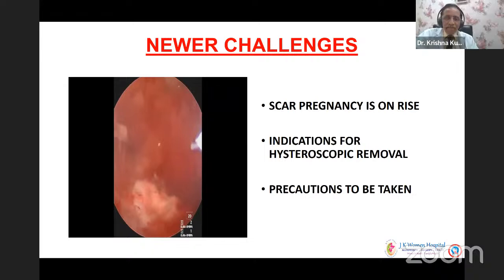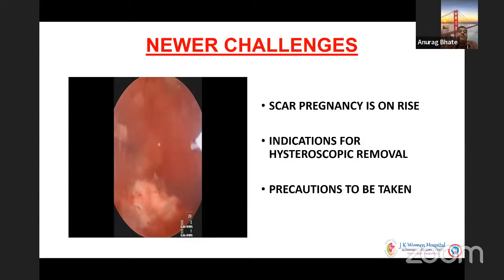No, Nitin is outside. Nitin is saying, just go inside and with the cold loop, just scrape out the entire tissue, and most of the time it doesn't bleed. Nitin, your signal is weak. You are outside.